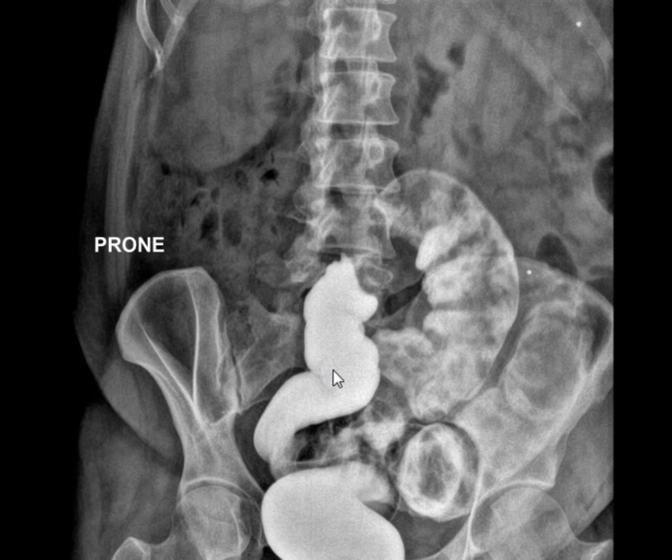It doesn't cause a focal segment. The ischemic colitis is also long segment, rarely causes a narrow segment. Crohn's disease, chronic ulcerative colitis, most of these are long segment involvement. Short segment: endometriosis, colon carcinoma.